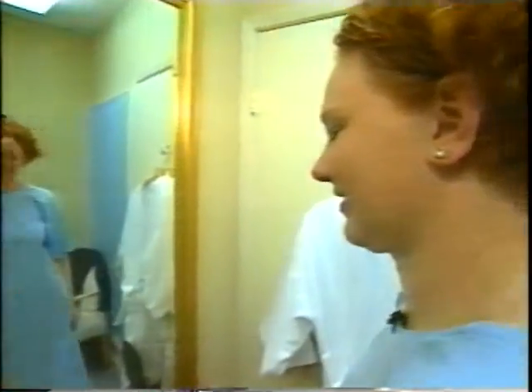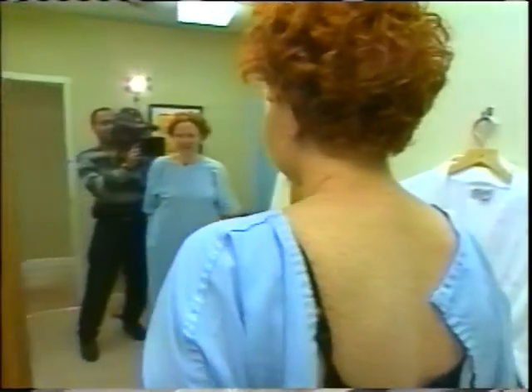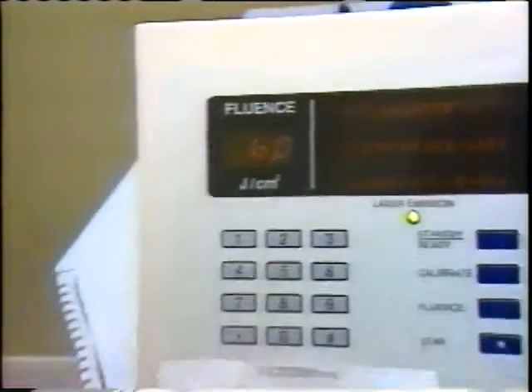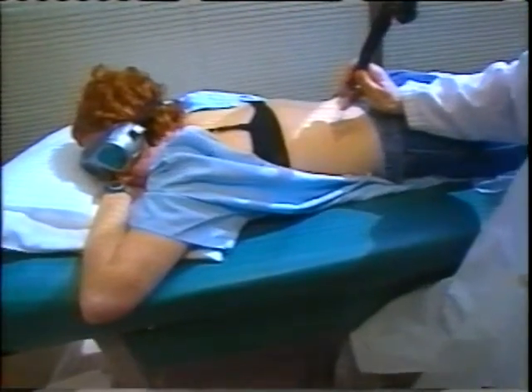I was thinking at the time when I was getting it more for just fun, when a bunch of us went and got tattoos. And now, getting older, 3 years later, I'm thinking, ooh, maybe I shouldn't have got it there. I see. So there'll be a little bit of bruising and crusting, Melanie, and then you want to just wash with soap and water.